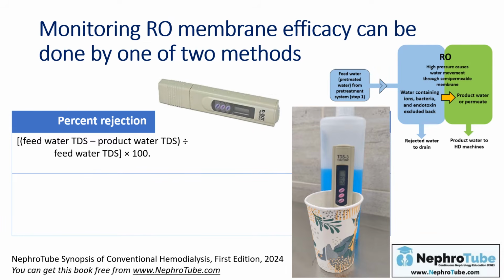You use this equation. You must measure the TDS in the feed water and the TDS in the product water, and then apply this equation.